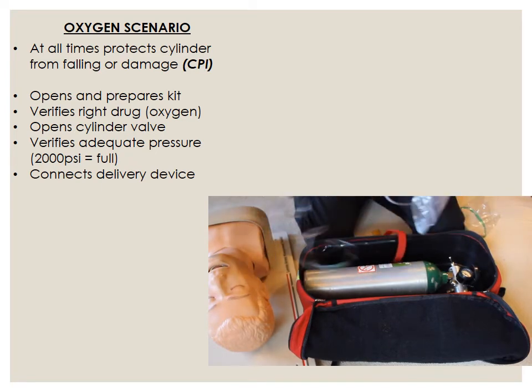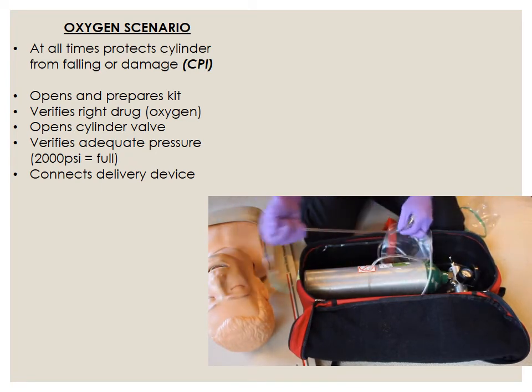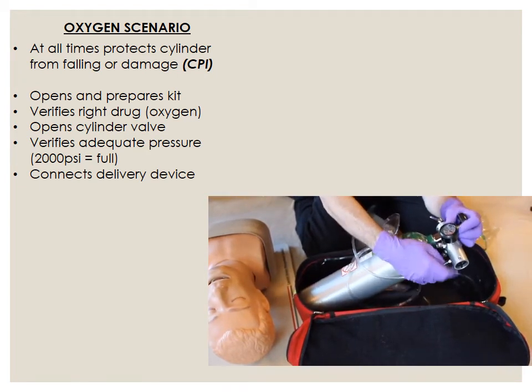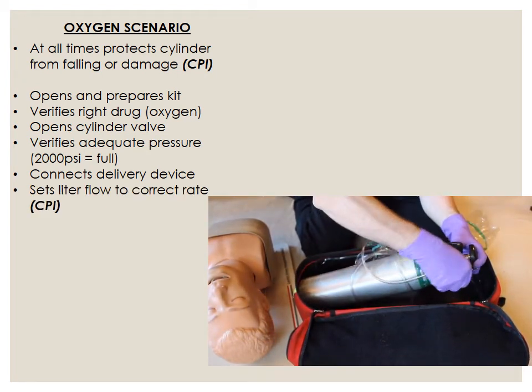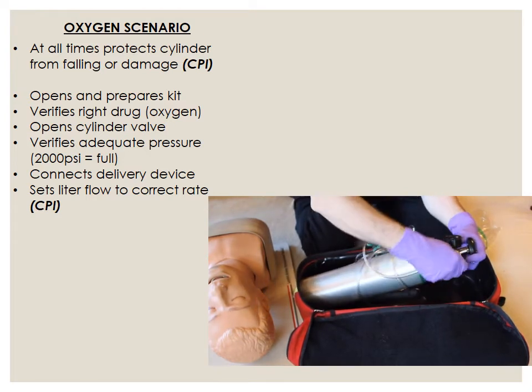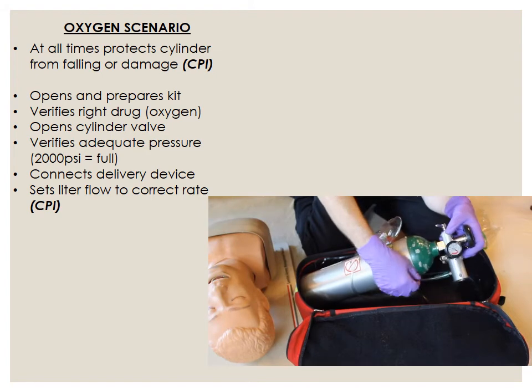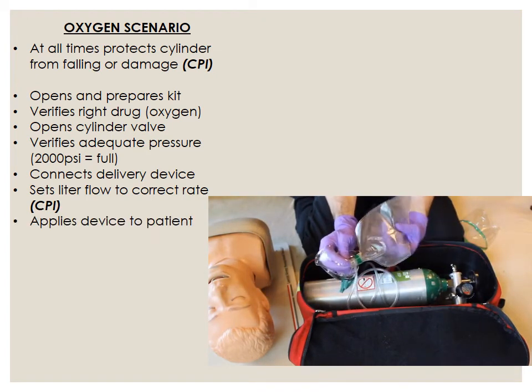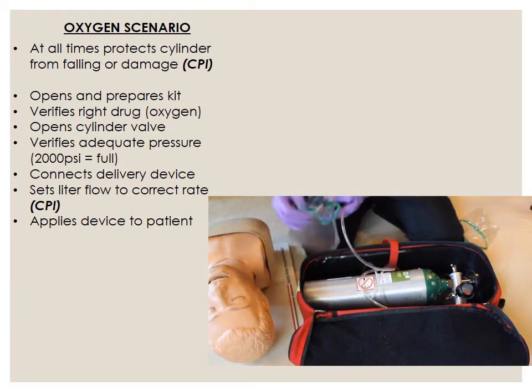Connect your delivery device to the regulator. Set the flow valve to the correct flow rate. Apply the delivery device to the patient using correct technique.